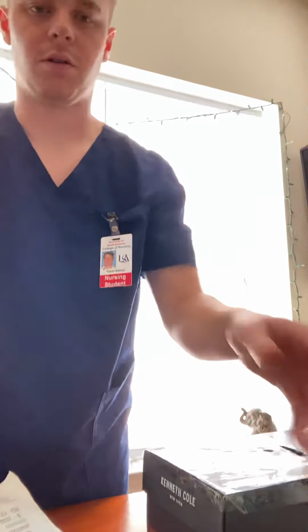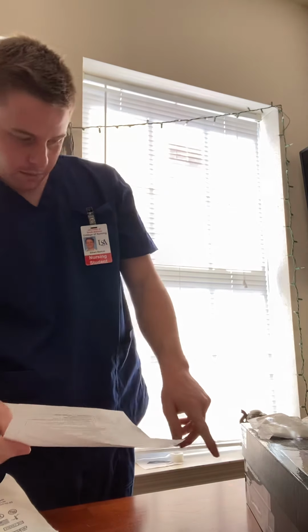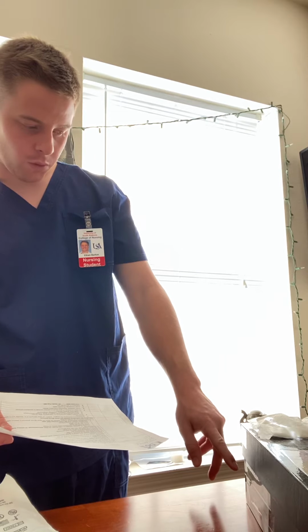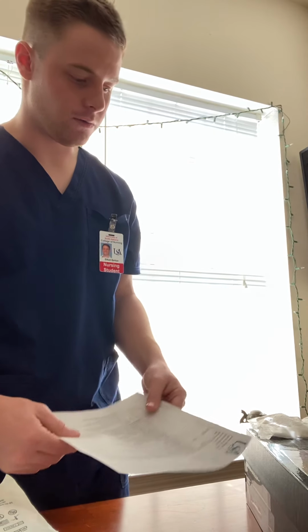All right, now I'm going to move the camera to look at my patient, Mr. Jaguar Jones. First I'm going to perform hand hygiene before I would touch the patient, and then I would look at his armband, see that his date of birth is 8/25/1963, and verify that on my care order form right here. Also verify his medical record number is 4176352, and I'll also see that his medical record number is 4176352 on the patient care order form.